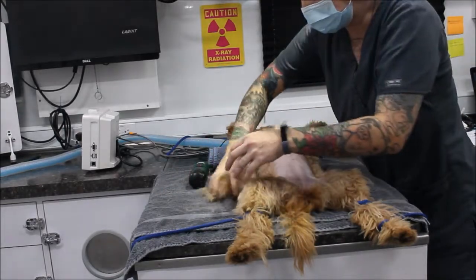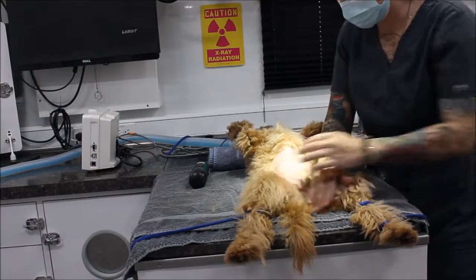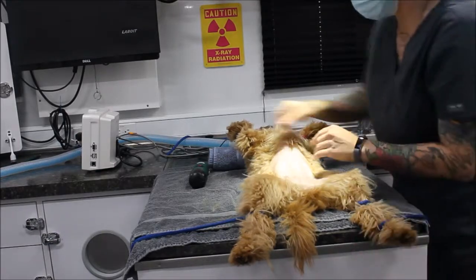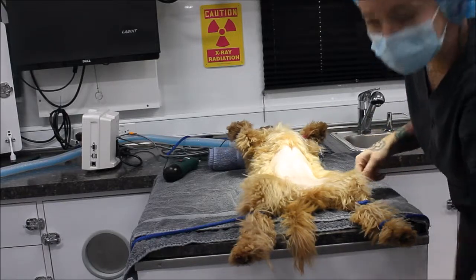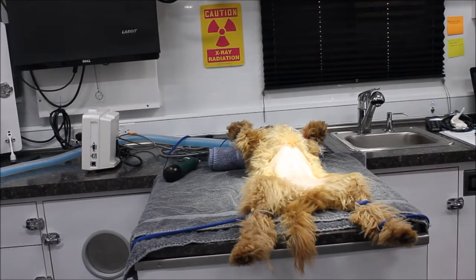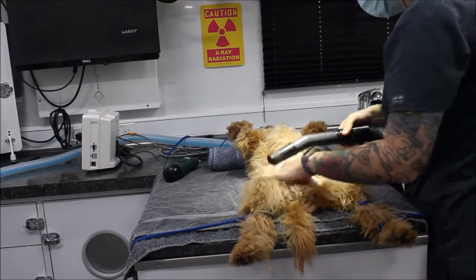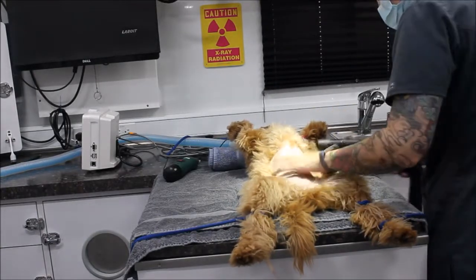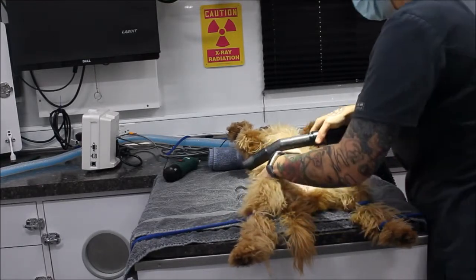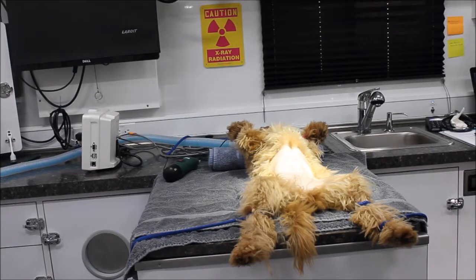I'm going to throw those away and get most of the chunks of hair here. Then I'm going to go ahead and get my vacuum and vacuum up any other small loose hairs that might be on her, because we don't want to take those into the OR with us.